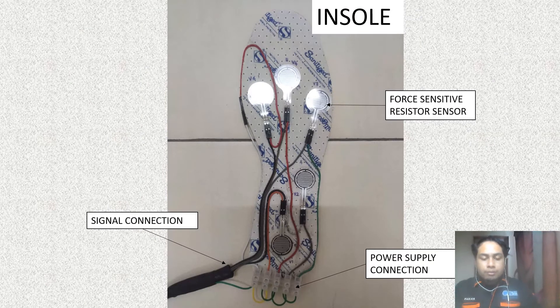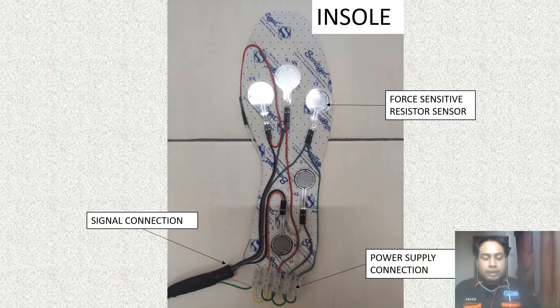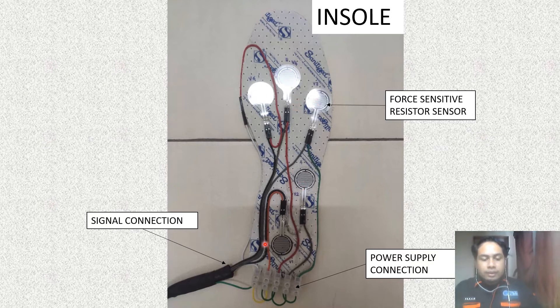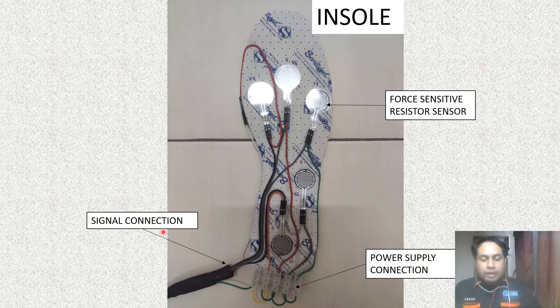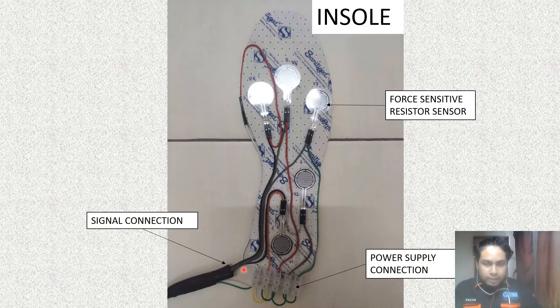This is what it looks like when the FSR sensors are attached above the insole. On the insole, I am using five FSR sensors. Each FSR sensor has two pins: one pin for the signal and another pin for the power supply. I am using a parallel circuit for the power supply.